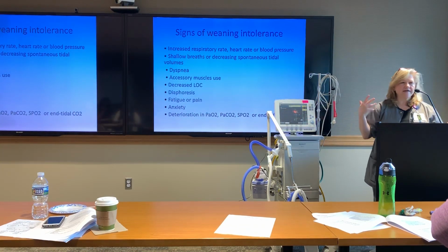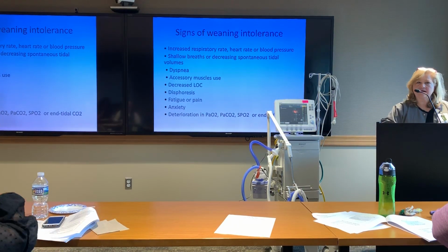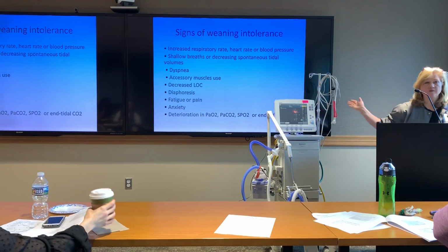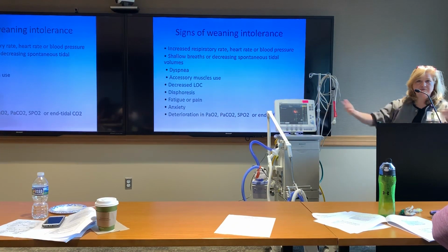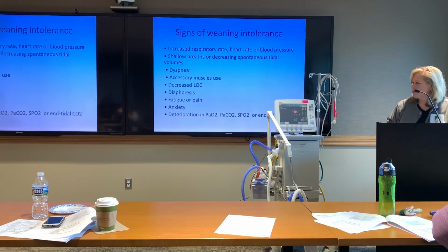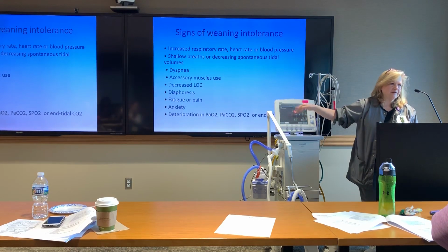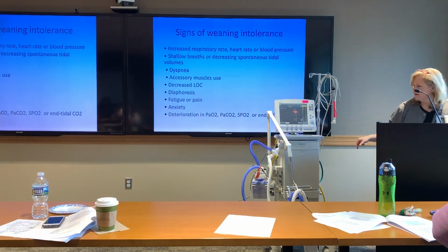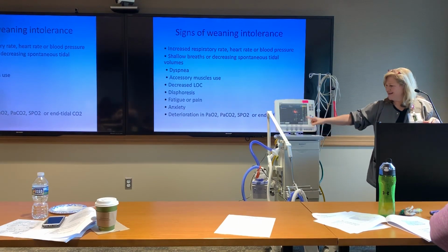It's just like when the doctor asks, well, how was his SBT? And I don't know, I was in another guy's room for 20 minutes of it. I don't have any idea. You can call it up and look, and everybody can see, a picture's worth 1,000 words. And then you can know how the patient was actually doing during his spontaneous breathing trial. And if he had gone apneic, these little ticks up here usually indicate that something different was going on. So anyway, it's just a nice thing to use to assess what your patient's doing.